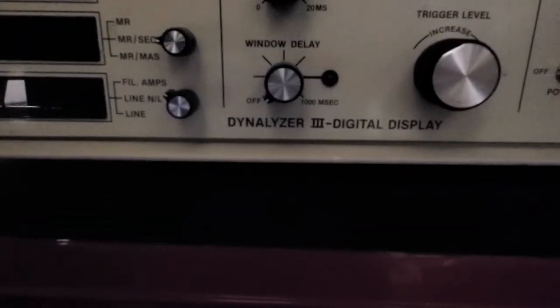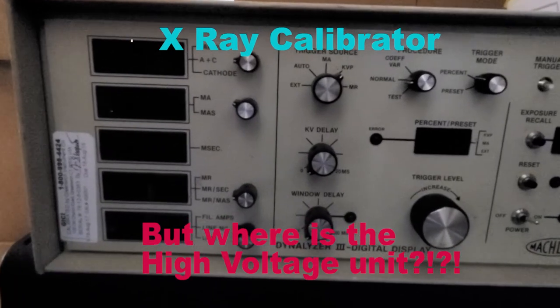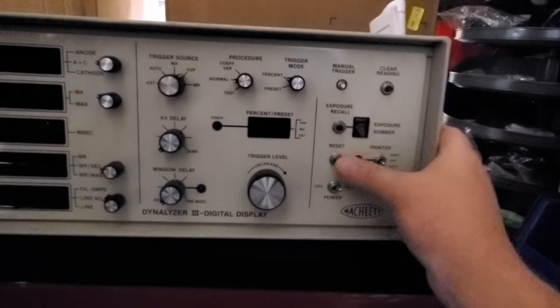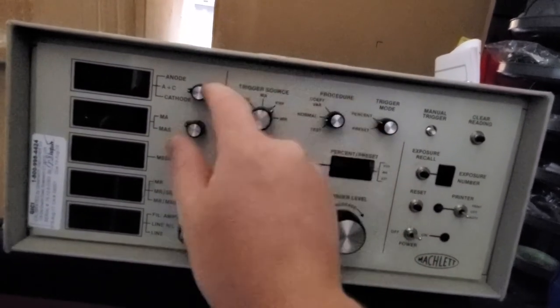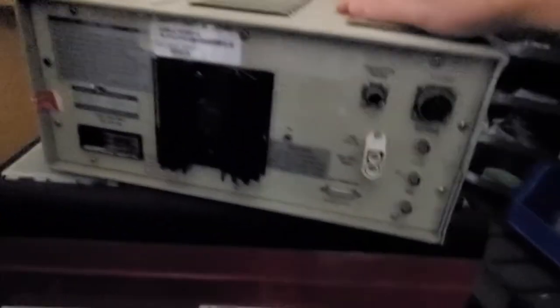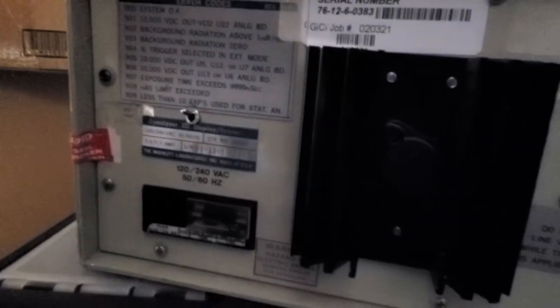That's right guys, I have a Machlett Dynalyzer 3. This is from back in the day — analog x-ray. It looks like it's in fantastic condition considering. Oh, that one's a little off. I bet you it powers right up too — obviously out of calibration. Look at that, the Dynalyzer.